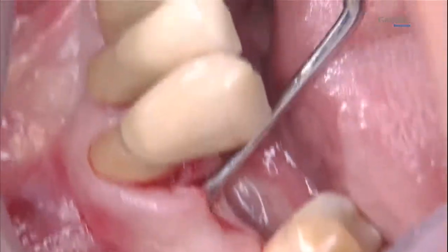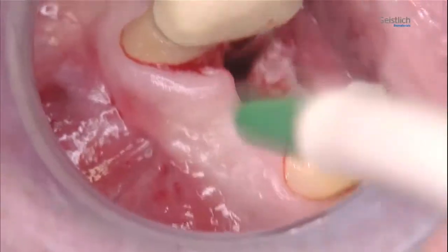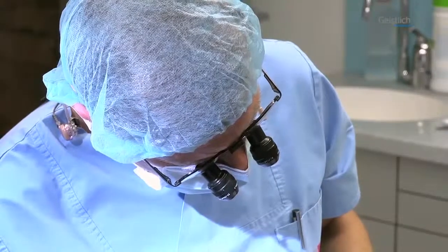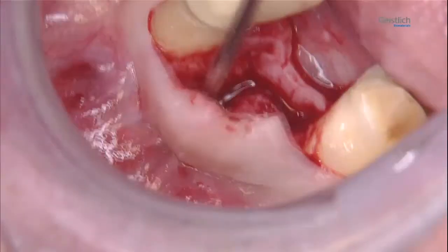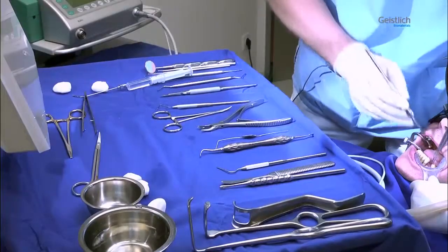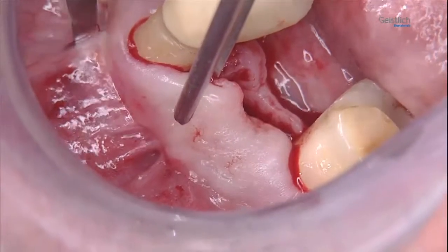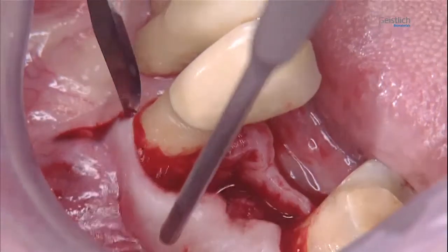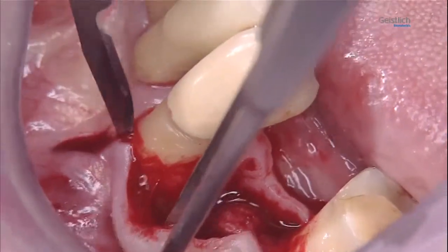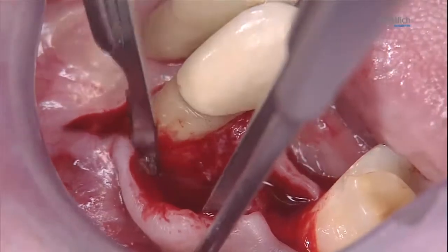This is followed by an initial mobilization of a flap, more cautiously in the lingual direction and more determinedly in the buccal direction. A relief incision vestibularly of tooth 3-3, slightly offset toward the mesial surface of the root, allows further elevation of a mucoperiosteal flap.